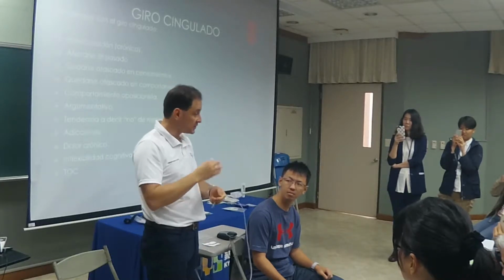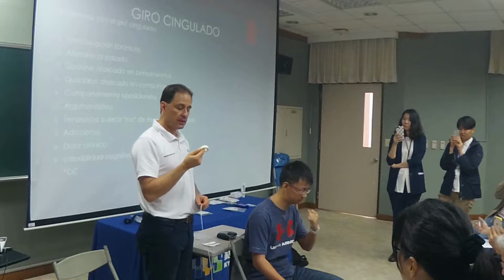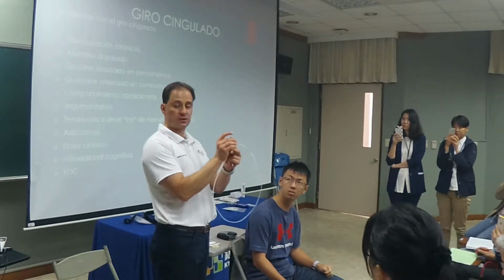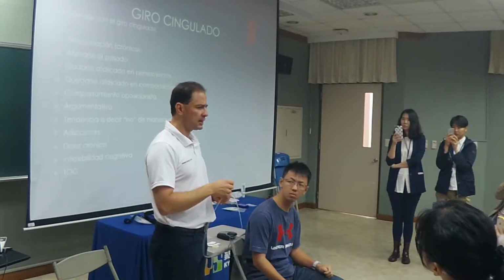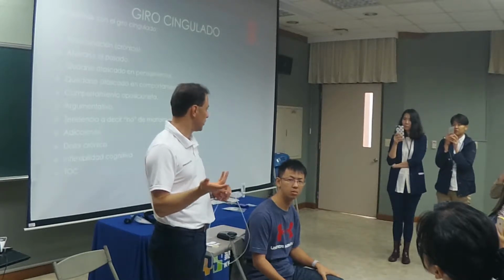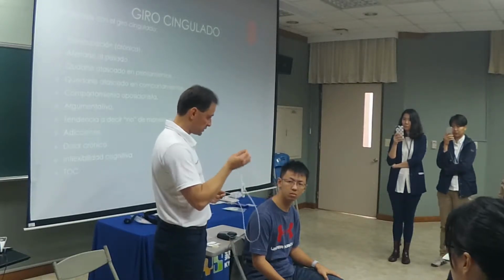Now, it comes with this tape. I'm going to recommend that you get something called Coban tape, C-O-B-A-N. It's an elastic tape, but it's not an adhesive like this one. Because with adhesive tape, what ends up happening is it chips the paint off the sensor, so it shortens its life. So the Coban is really useful. You can get it at a major drugstore, or you can ask a physical therapist. It sticks on itself but is non-adhesive, so it will protect the sensor. But for practical purposes, we're going to use that.